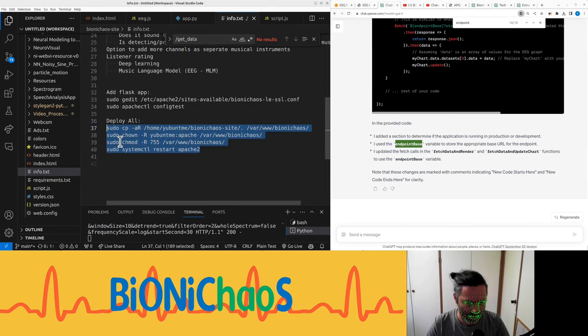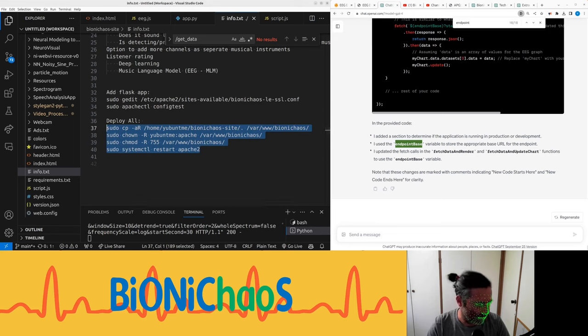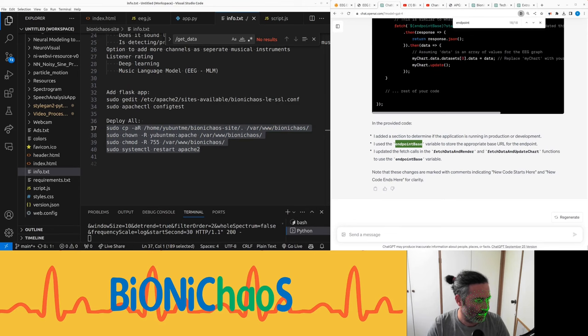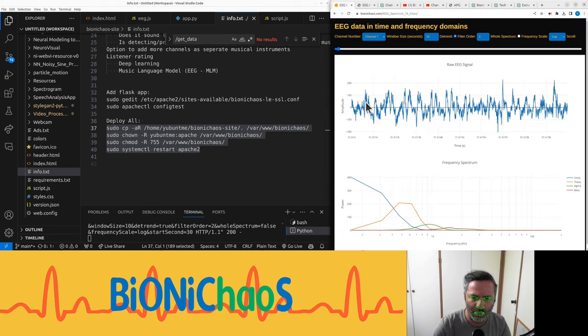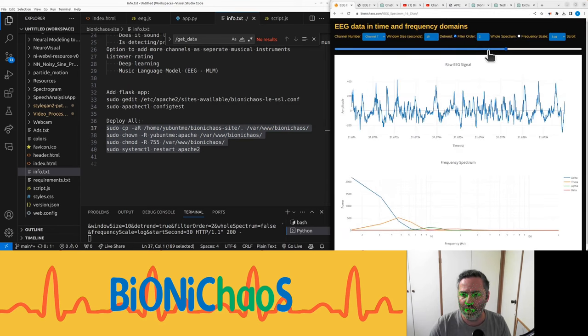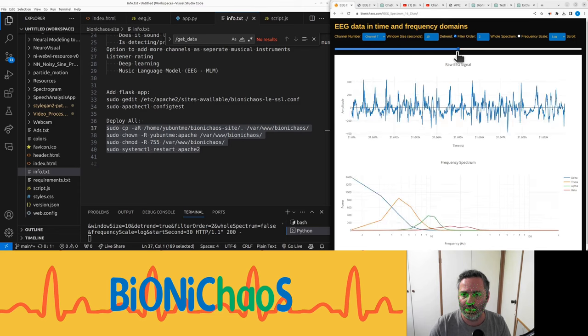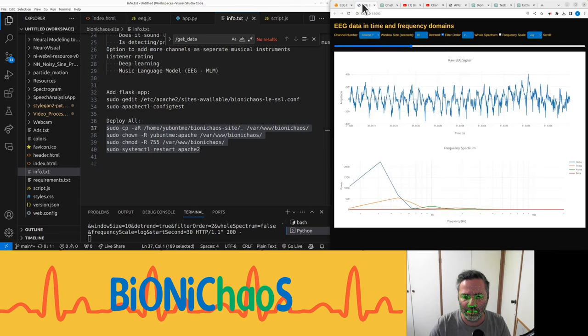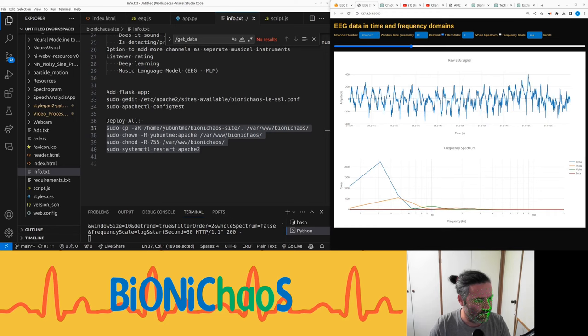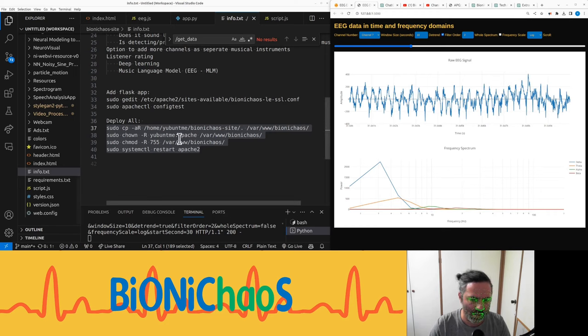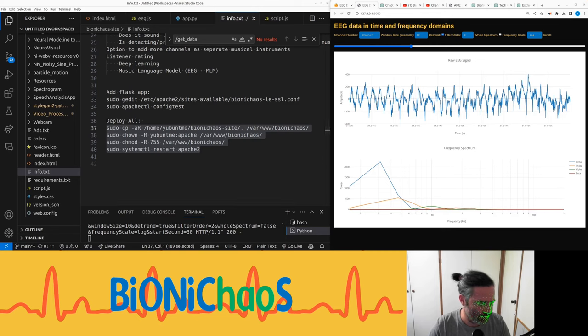And we need this to deploy. Deploy, deploy, deploy. It should work. Yay. Okay, that was quick and easy.